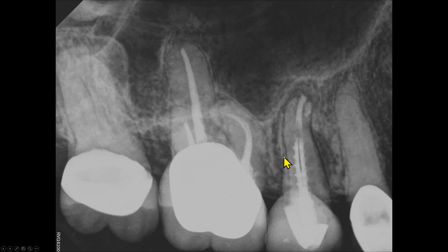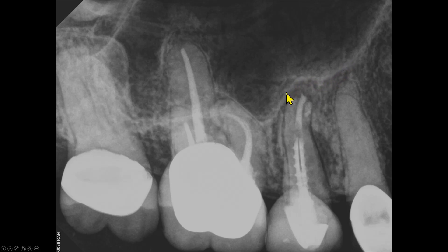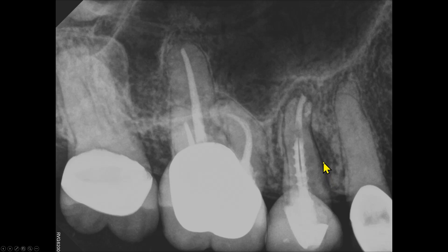This is the lamina dura — the lamina dura is lost here and there is a radiolucency. Looking at the floor of the maxillary sinus, the sinus floor appears slightly elevated. On the mesial aspect we see a radiolucency and there is no distinct corticated lamina dura.